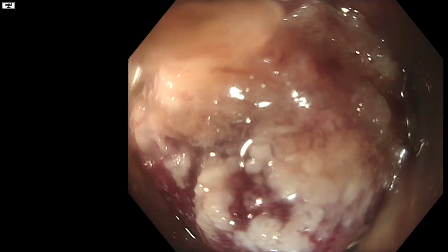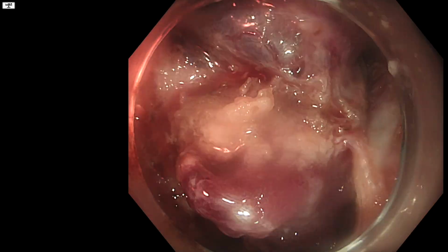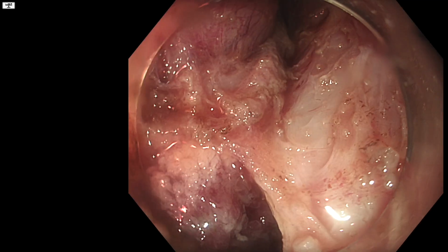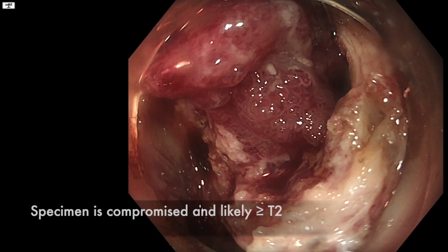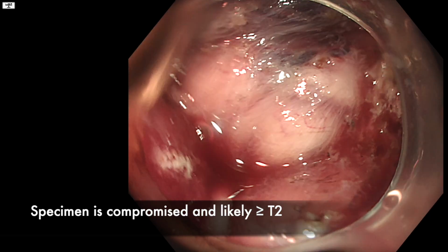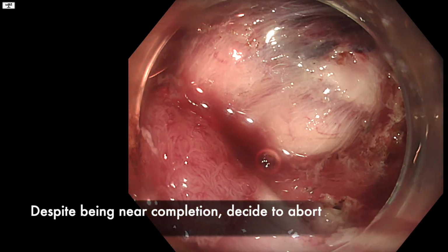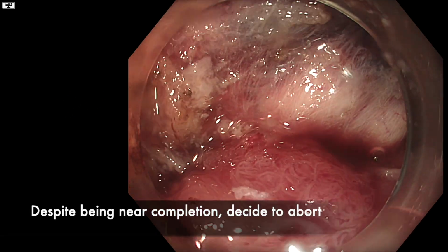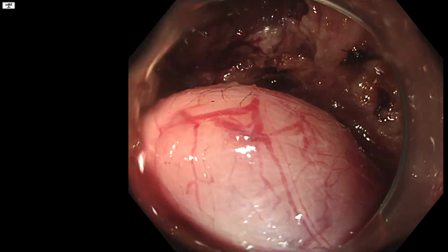So we're going to check the situation, and again, having exerted a lot of pressure, I've just torn right through the lesion here. It's now very obvious what's going on, and I'm now pretty certain that this is no longer a T1. So despite having completed almost 90% of the resection, I decide the safest and most reasonable option is to abort.